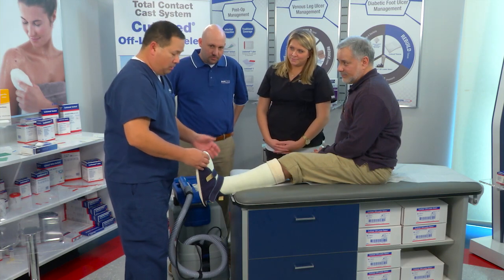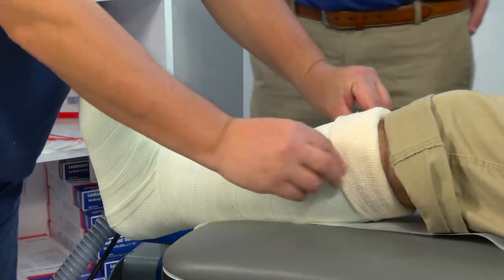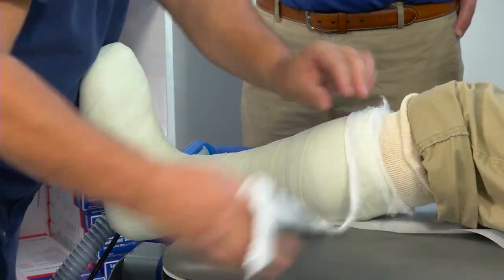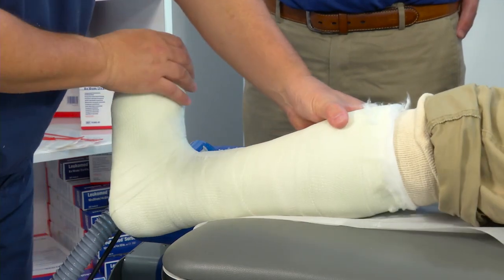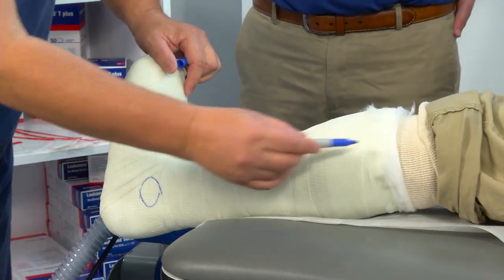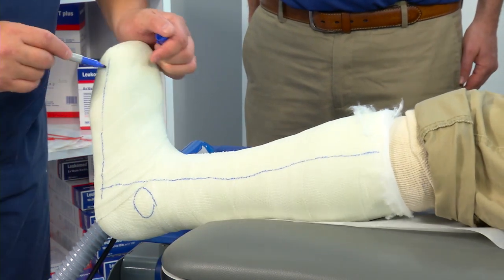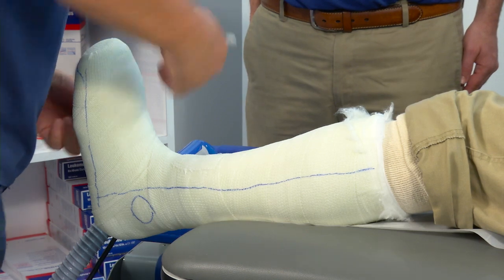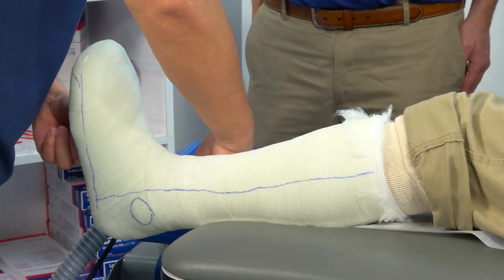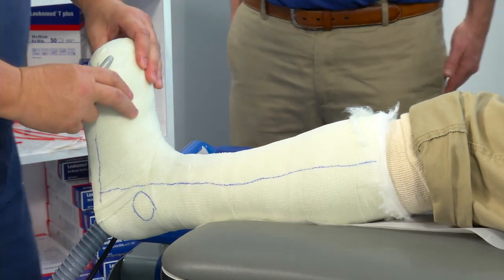Once they come back on the weekly basis, you're going to remove the shoe. I'm going to take this flap up that we put on and take off that cuff of padding. Once I get that out, I want to draw some lines where I want to cut — my landmarks are the malleolei. I want to cut in front of one malleolus and behind the other, and cut underneath the toes. Cutting it that way will give you a hinged effect, which will be important.